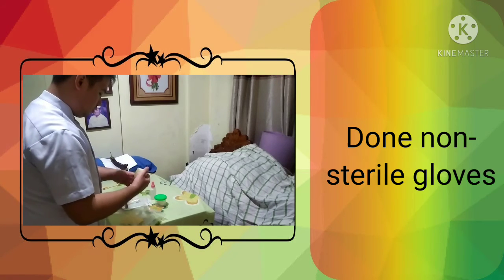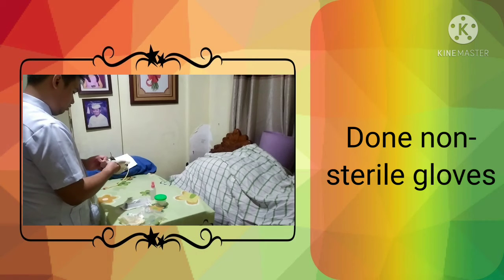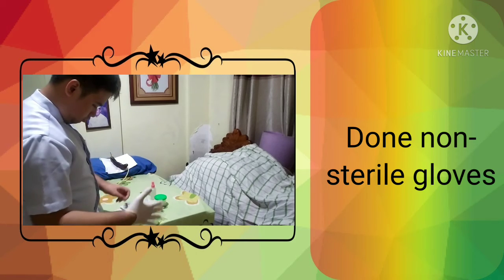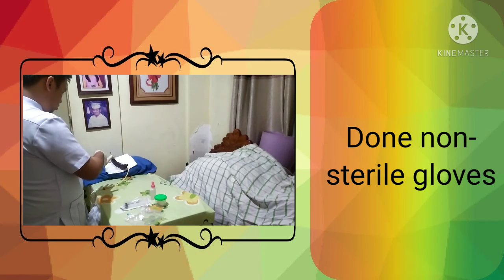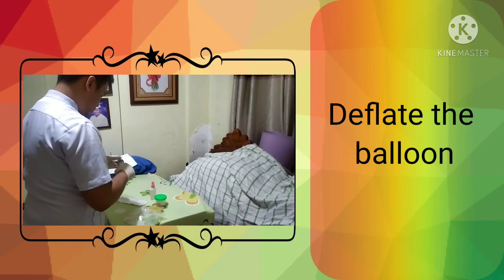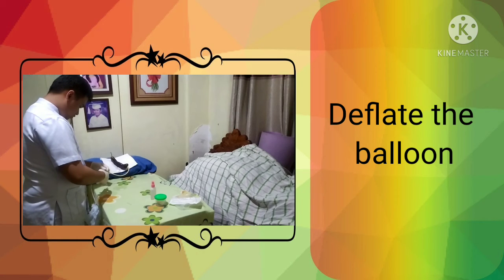Don non-sterile gloves. Deflate the balloon of the Foley catheter by aspirating the equal amount of fluids that is inserted to the Foley catheter.